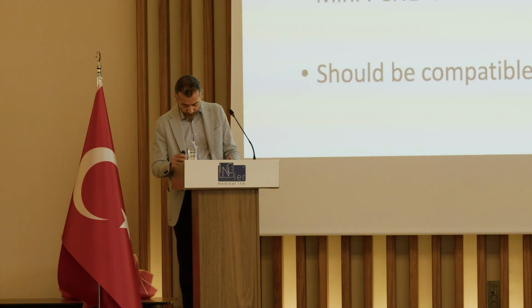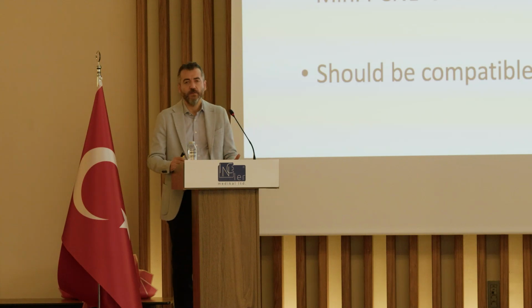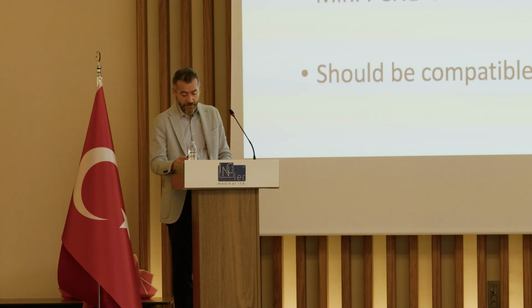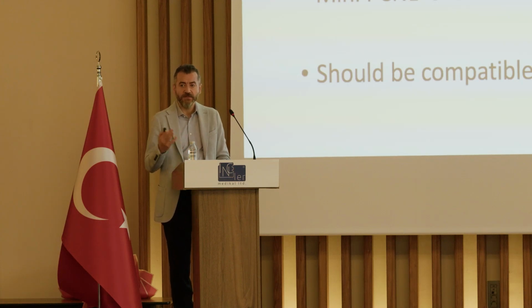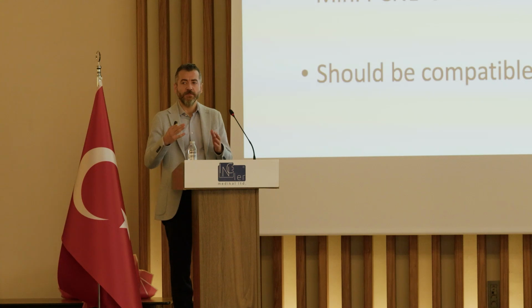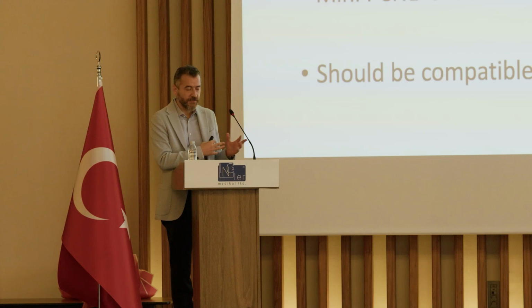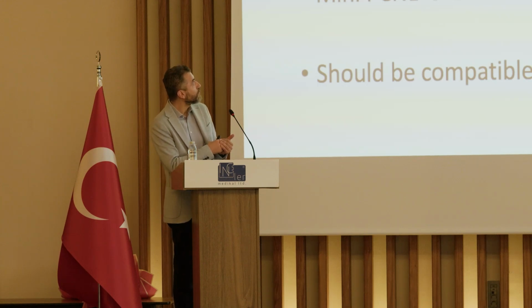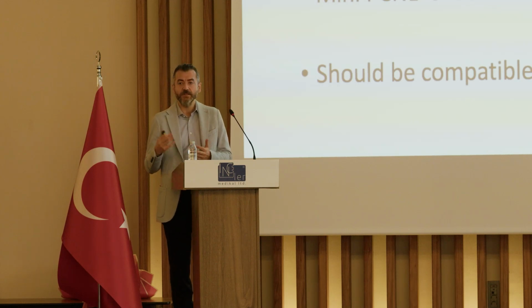So we need to determine for which case, which device, which lithotripsy to be efficient. In the end, we also need enough knowledge about the technical details of the lithotripter. I mean, with the lasers, we also have different types of probes and different types of lasers. Some of them are good for dusting and some are good for fragmentation. But it's also true for the other intracorporeal lithotripters. So we need to have enough knowledge about the available sizes of the probes and the technique that we can apply. And these should actually be compatible with the endoscope of the surgeon.